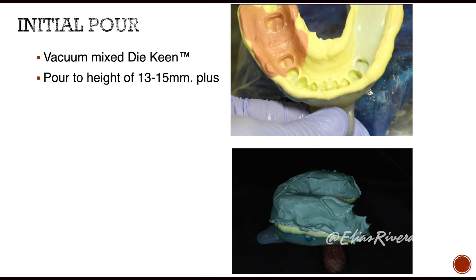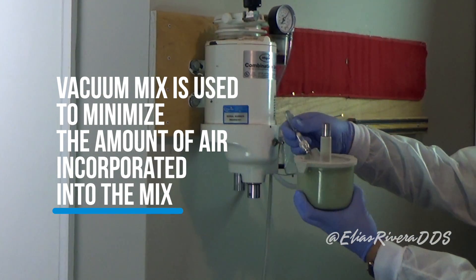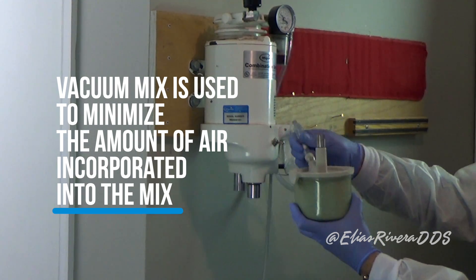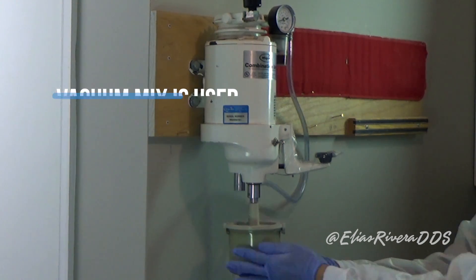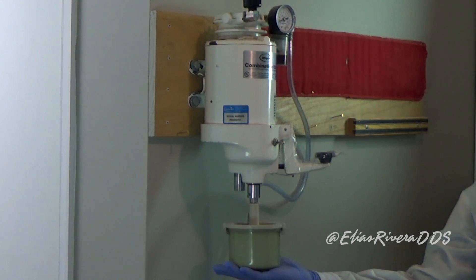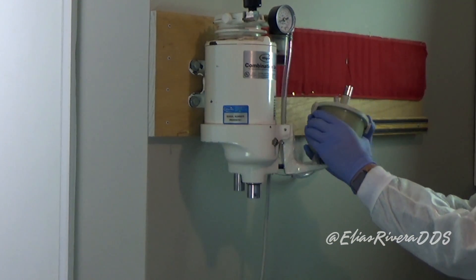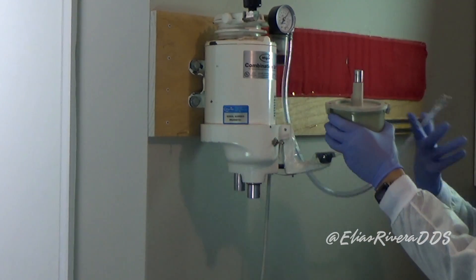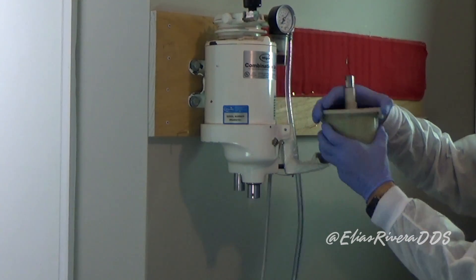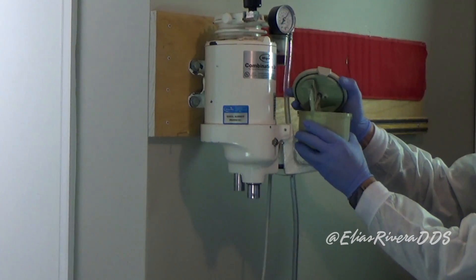We're going to start with the impression we made last time. For this, we're going to use a vacuum mixer. A vacuum mixer is used to minimize the amount of air incorporated in the mix. Once the stone is mixed, we're ready to pour.